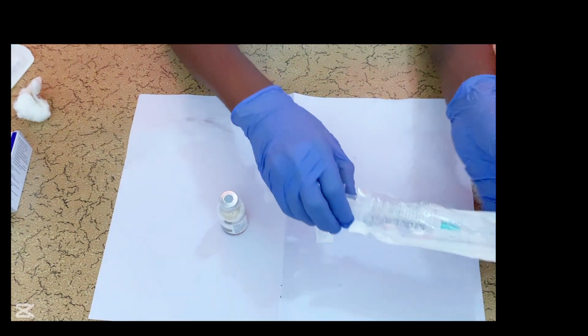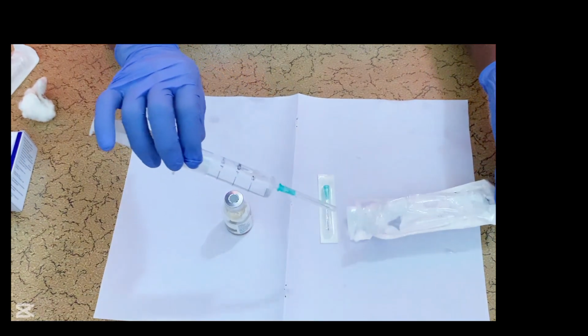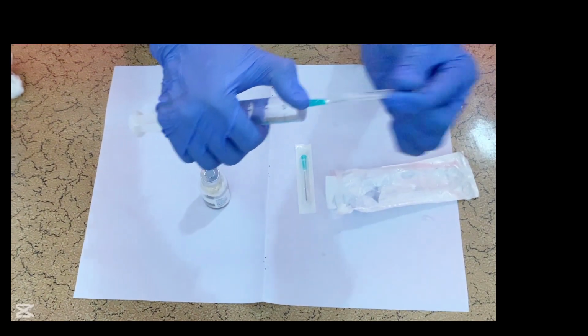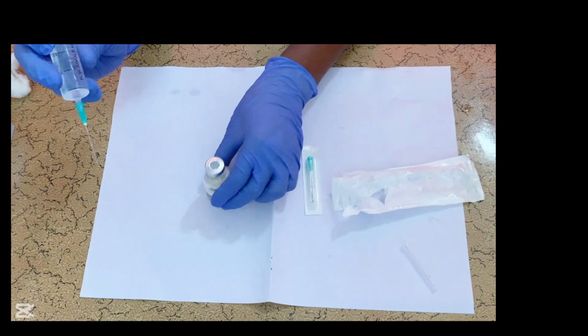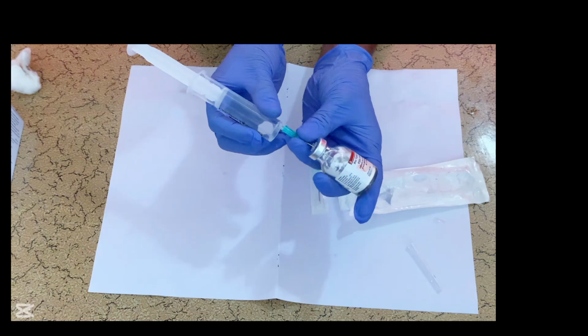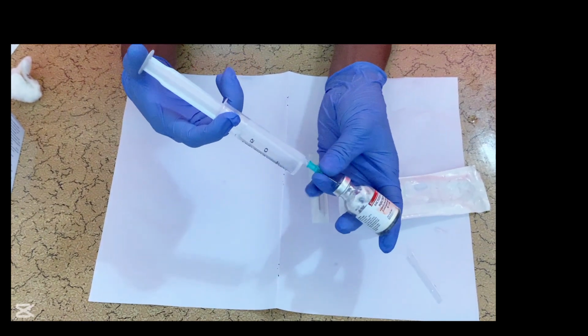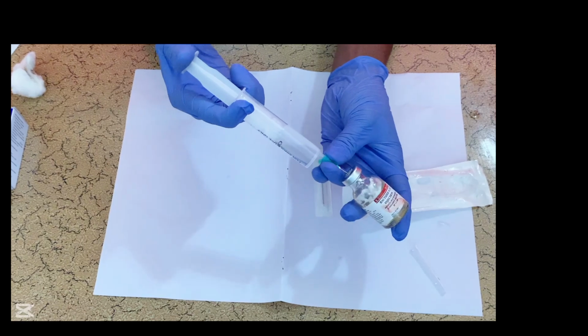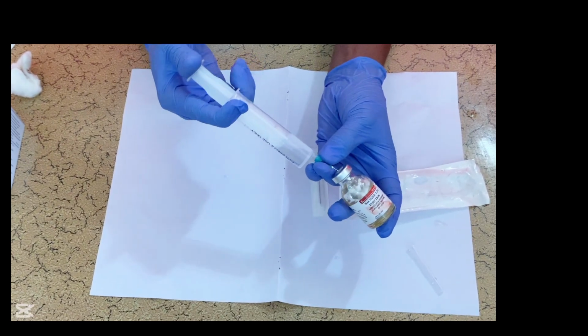Then you get the syringe from the packaging. Then make sure you remove the cap of the needle. Then you inject it into the vial. Then you transfer all the sterile water for injection into the vial. So this is how you are going to reconstitute the drug.